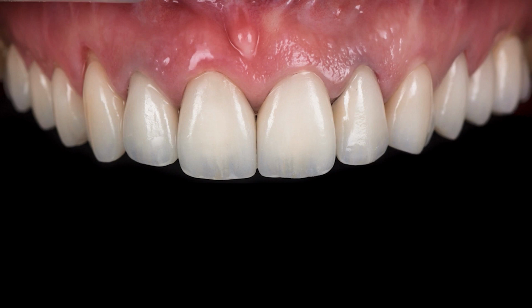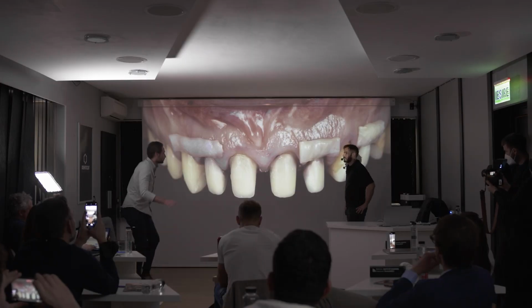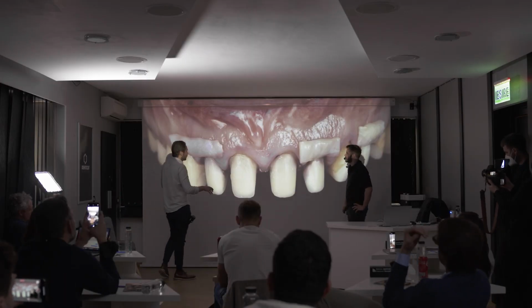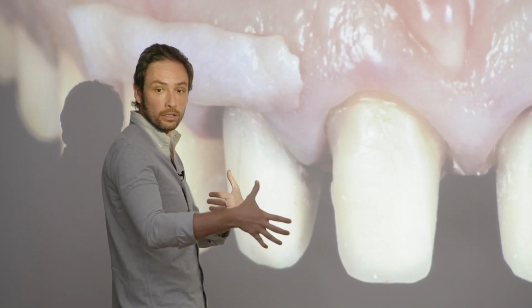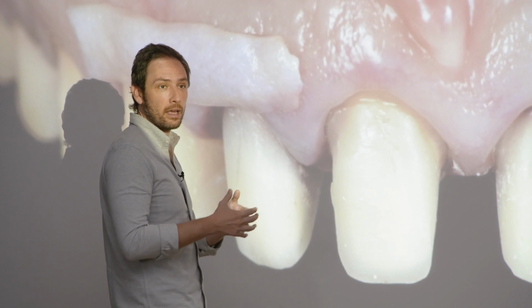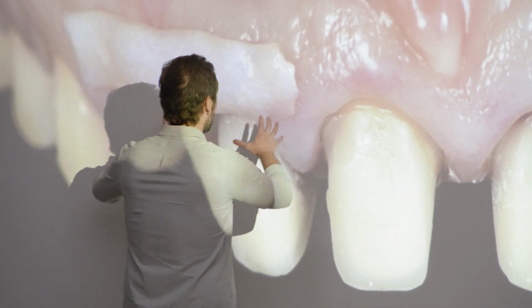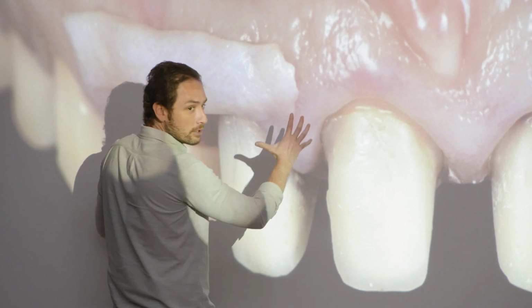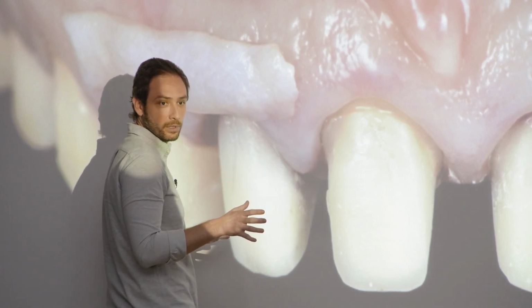Trying everything, and then again, Gustavo and Marcelo. Yes, sure. The same, exactly the same as last time, but just on top of natural teeth. So now I don't need like a lot of tissue, okay? Imagine like the previous case I had to add a lot of tissue, so I decided to remove a lot. Again, here, I don't want to create like a bulky situation because it's going to be very weird at the end of the treatment, right?